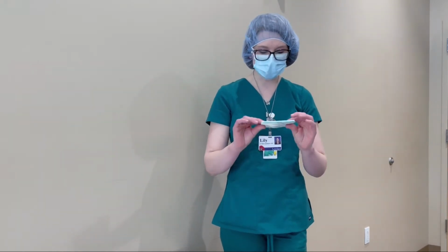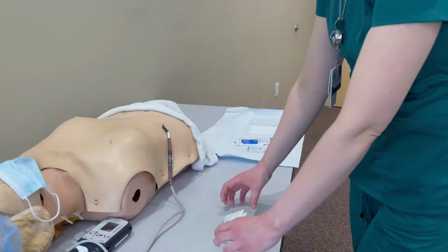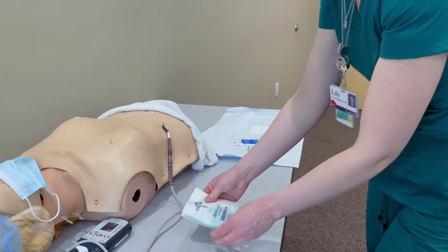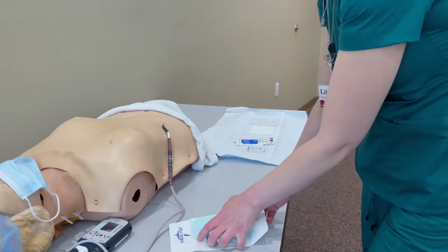So your kit is going to come with 2 pairs of sterile gloves of size medium and large. If neither of these sterile gloves fit your family member, we can always add in an additional prescription for another size. So just let your LVAD team know if these gloves do not fit the person that is going to be changing your dressing. All right, so we're going to go ahead and open your sterile gloves. On the outside, you can touch this. This is non-sterile, so you're going to unfold, and then open up.